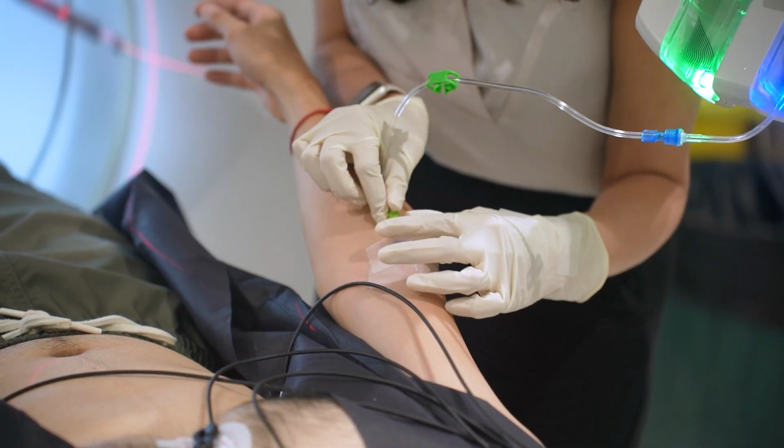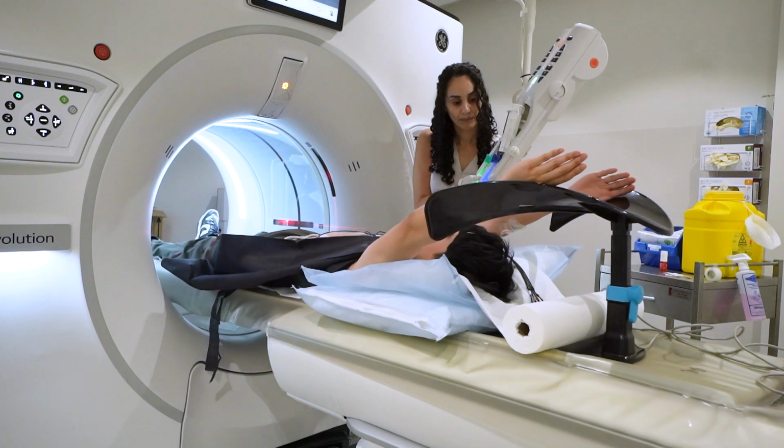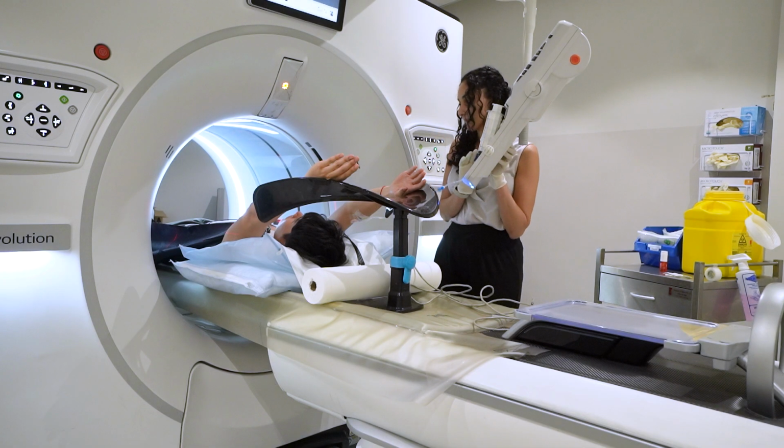Once the heart rate is slow and steady, often under 60 beats per minute, and when the arteries are dilated, the technician will inject the contrast dye into a vein in your arm. The scanner will anticipate when the injected dye will reach the coronary arteries, and you'll be asked to hold your breath while the scanner takes images of your heart. Modern scanners are fast and powerful enough to take a picture of the entire heart over the period of less than 1 heartbeat. After the scan, you'll be monitored for a short time to ensure there are no ill effects from the medications or the contrast.